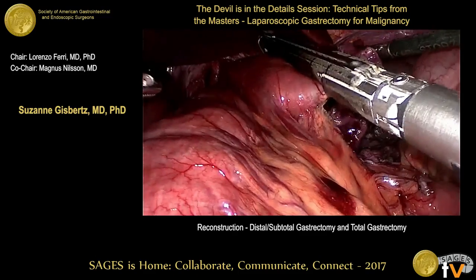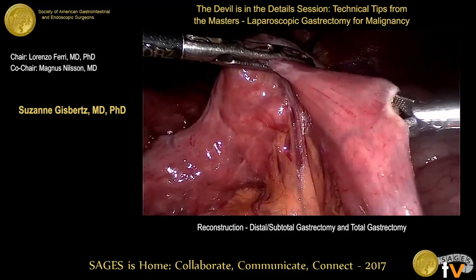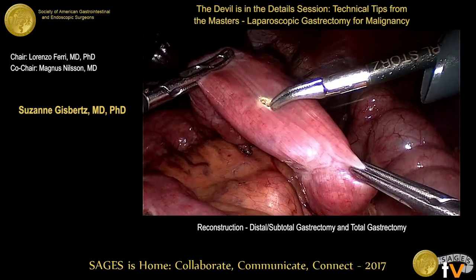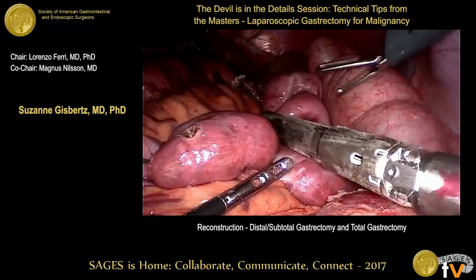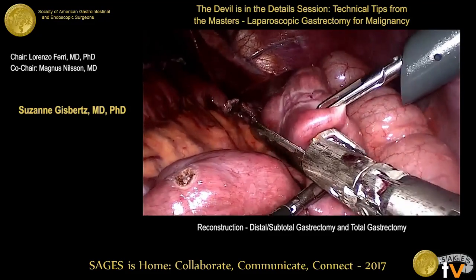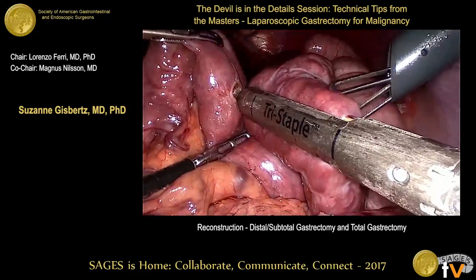Miguel uses the left lower quadrant incision, which he enlarges while maintaining pneumoperitoneum, because it's a small incision. He prefers to use that same lateral left incision to introduce the stapler — and it also serves for retrieval of the specimen. The jejunojejunostomy is then performed using the linear stapler.